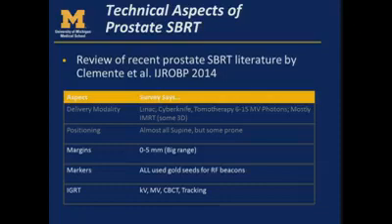This is something that I think we have to be very careful about. Many of you may have seen the paper a few years ago looking at the reduced local control and outcomes for prostate cancer using IGRT in small margins. So you just have to be careful. You want to make sure that your margins are appropriate with your IGRT, and I think each clinic kind of has to evaluate that on their own with their own technology.